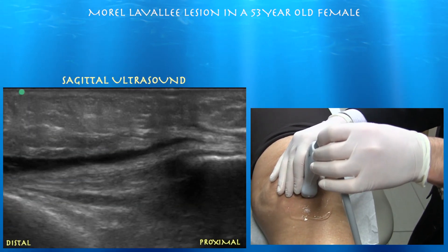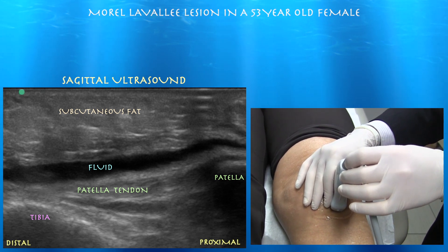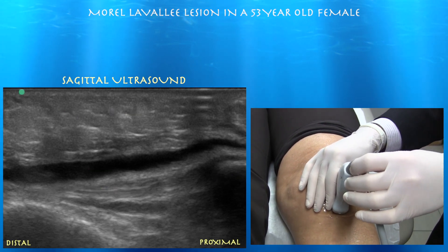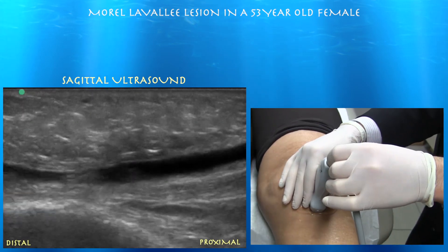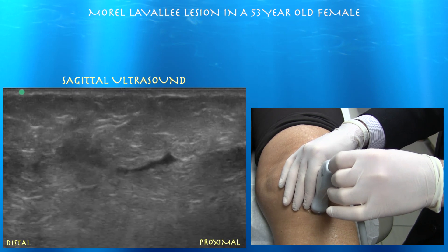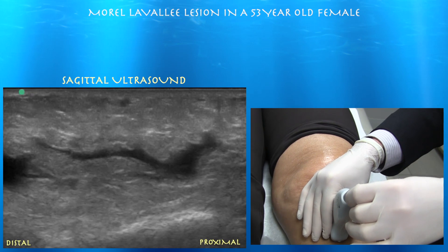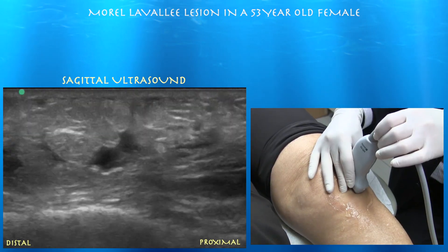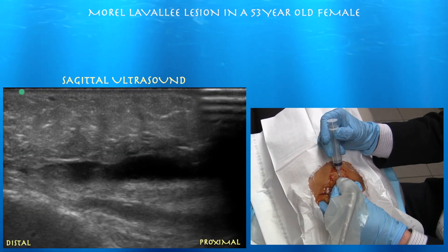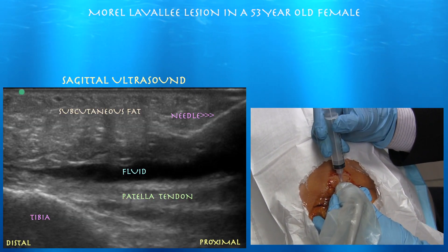We're looking at the patella tendon in long axis, right in the mid-zone, and you can see all that fluid on top of it. Going down past the insertion on the tibial tuberosity, you can see that fluid tracking throughout her subcutaneous tissue. The tendon itself looks relatively preserved. I think this is more of a Morel-Lavallée lesion because it was so extensive — really going beyond the infrapatellar bursa up into the pre-patella bursa region.